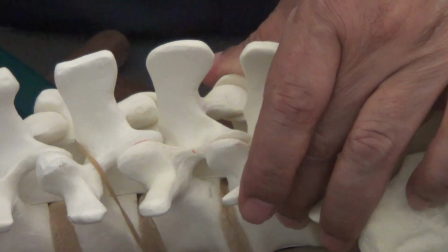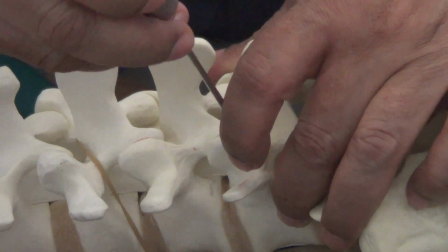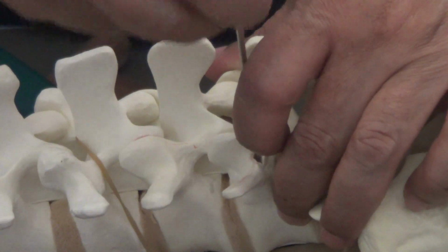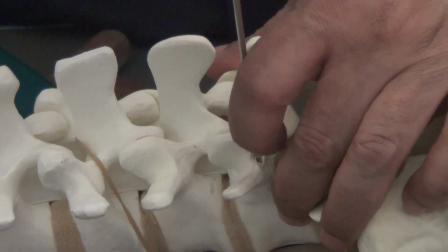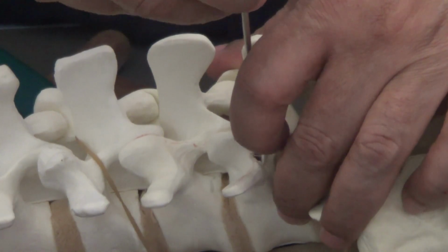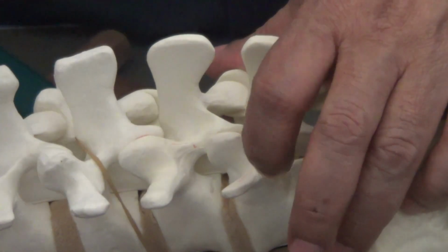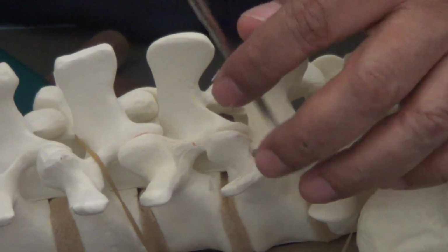And then what is very important is that you sound your hole, right? So you scratch the medial border. You should be feeling the medial border there. Outer border, superior border, inferior border. If you penetrate the medial border, then you land up in the canal, right? If you penetrate the inferior border, then you land up in the foramina, and the nerve root is there. So very important to palpate your borders, then further go down.